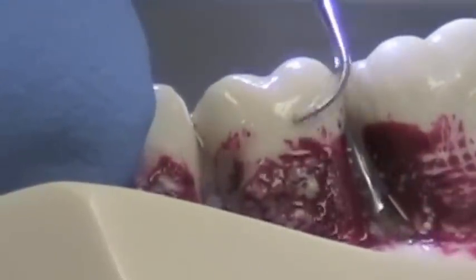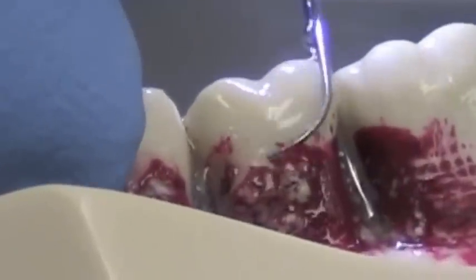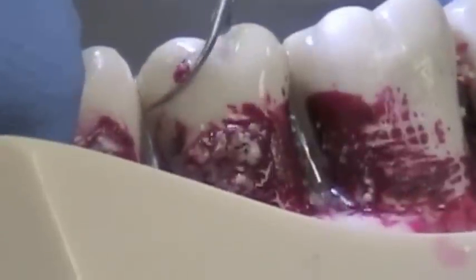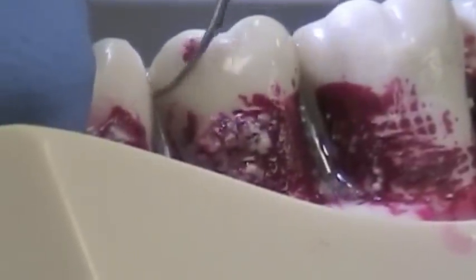Very, very precise, light touch. Excellent tip, but you do have to be very, very methodical, slow, and precise with this tip.